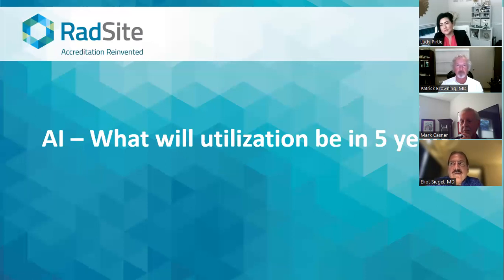I don't want to have each algorithm consumed separately with a separate computer program in a separate location where I've got to go out to a cloud location. It all has to be integrated into my image interpretation workflow, whether that's into my PACS system or advanced visualization system or even my reporting system. And that really does not exist now.